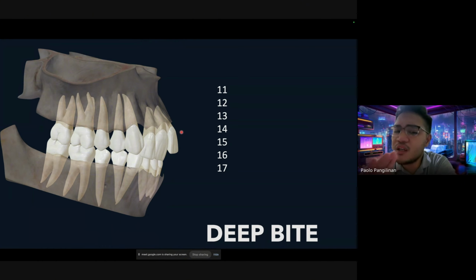But for clear aligners, it's not entirely different. To be perfectly honest, it's not entirely different. It's still the same fundamentals in orthodontics. The only difference is that you have to stage it. You have to recognize the movements, the physical movements, everything that happens in physics, and then convert it into a simulation. That's why staging is given birth.